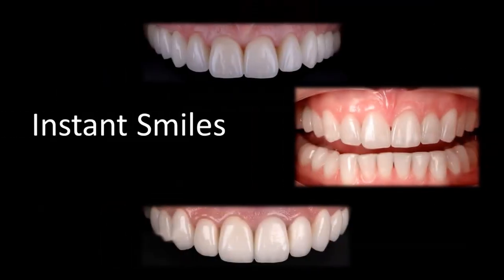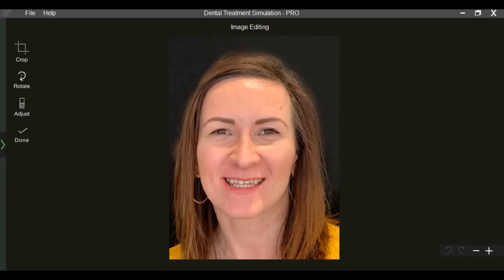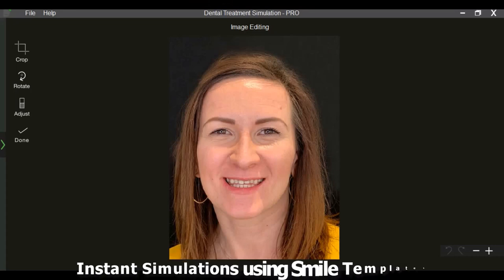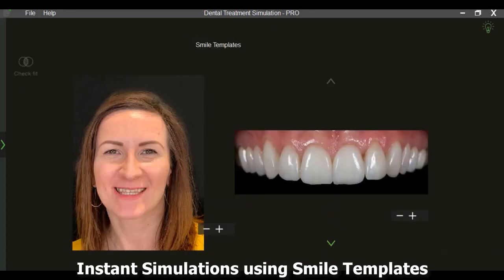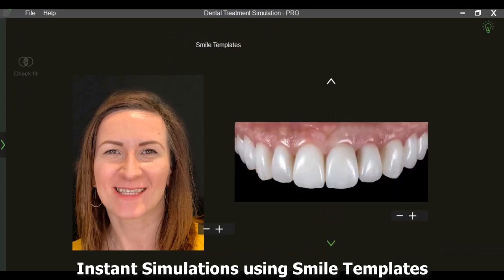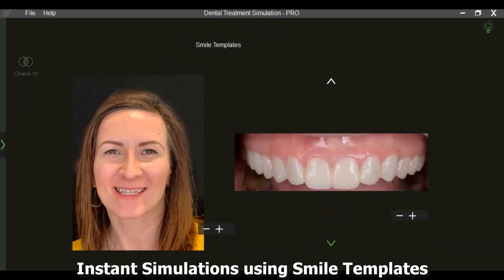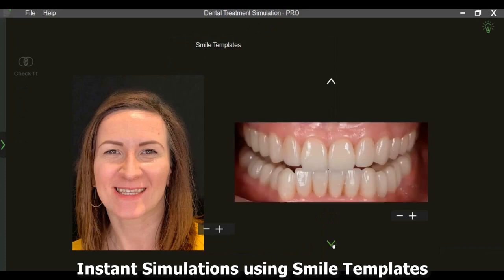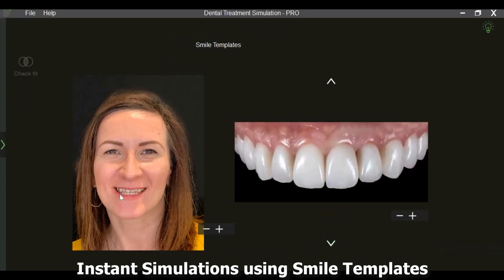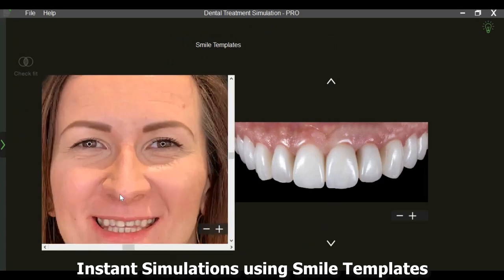Let us see how to create super quick simulations and get patients motivated and excited right at the beginning. DTS Pro has a library of smile templates that can be superimposed on the patient's smile to carry out simulations in less than a minute.